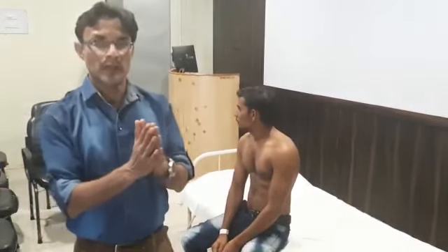So students, we will be depicting on a dummy patient what are the different types of murmurs. I will be creating the sound of the murmur — though it won't be the reality, you will come to know how a murmur is heard. We will be dividing this video into two parts: murmurs of the aortic valve and murmurs of the mitral valve. The only motive is to show how exactly the patient is to be examined and how the murmur is heard, scientifically speaking.